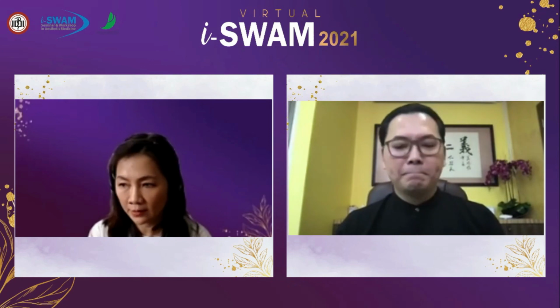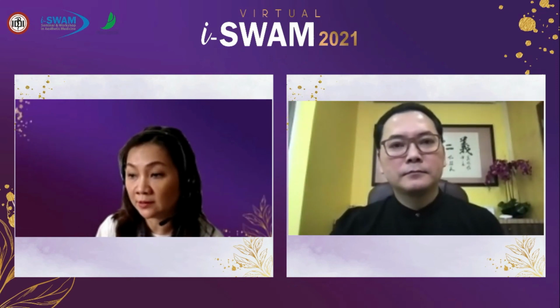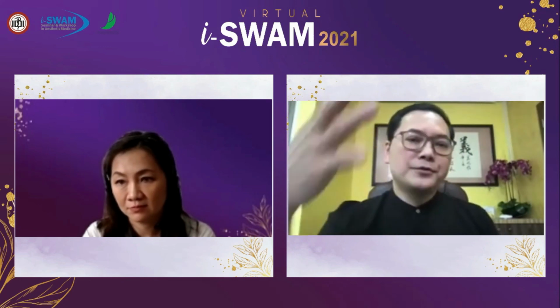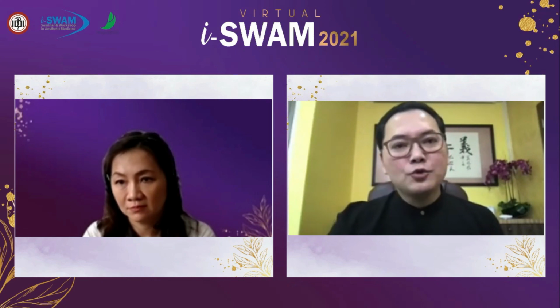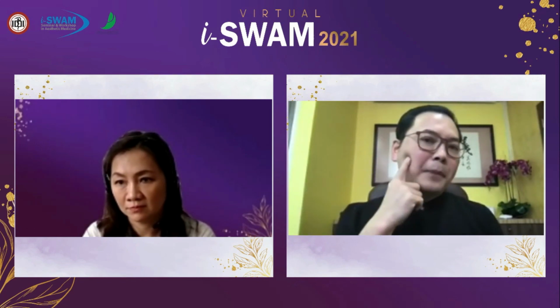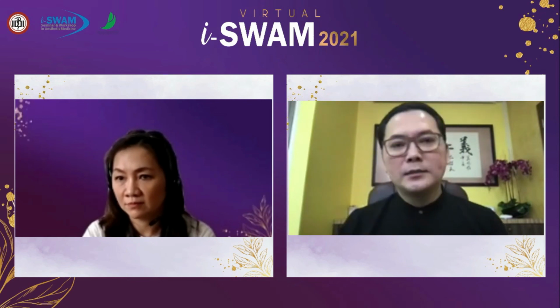Yeah. Okay. And then we have another question again from Dr. Ubeta. How long will the dimple and irregularities take to disappear? Maybe this means if we do not do anything after insertion of the thread. Very frankly, at the entry part, it really lasts very long, at least 3 or 4 months sometimes, depending on how superficially you catch the cutaneous layer. If at the middle part or the exit point, it usually lasts for at least 2 weeks to a month. But the entry point is always a longer period.